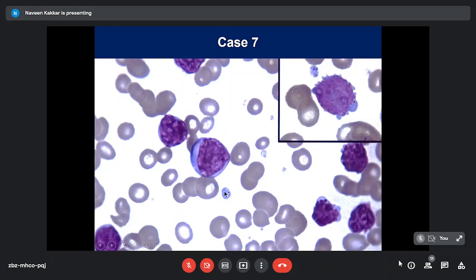And what you can see here is that I'm pointing out 1, 2, 3, 4. These are not platelets. These are actually budded cytoplasmic fragments from leukemic blasts. Leukemic blasts are fragile, so they can shed off cytoplasm like that, and if it is of the size of a platelet, they can be counted as platelets.